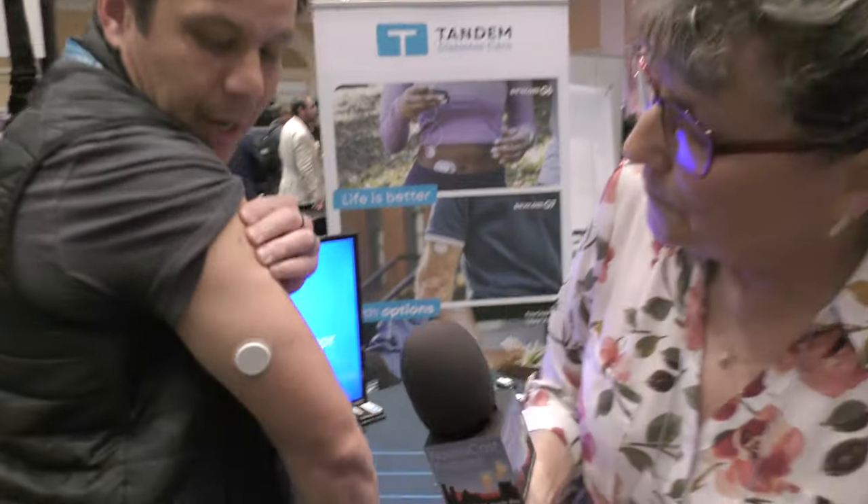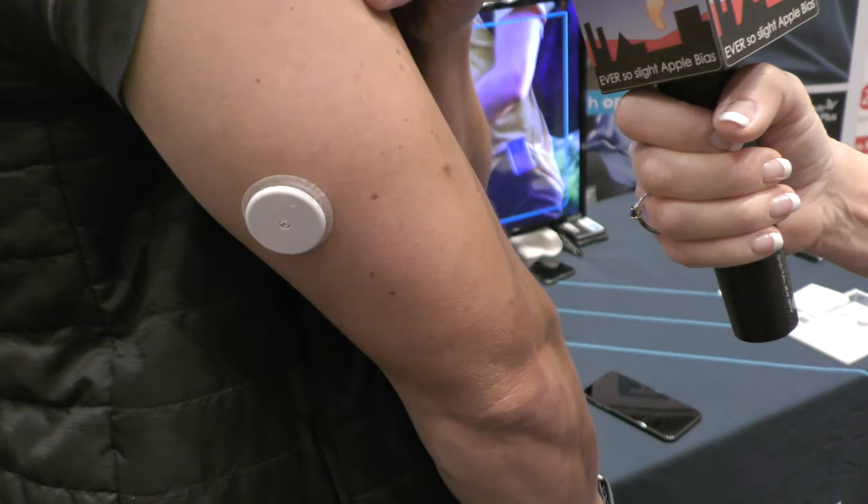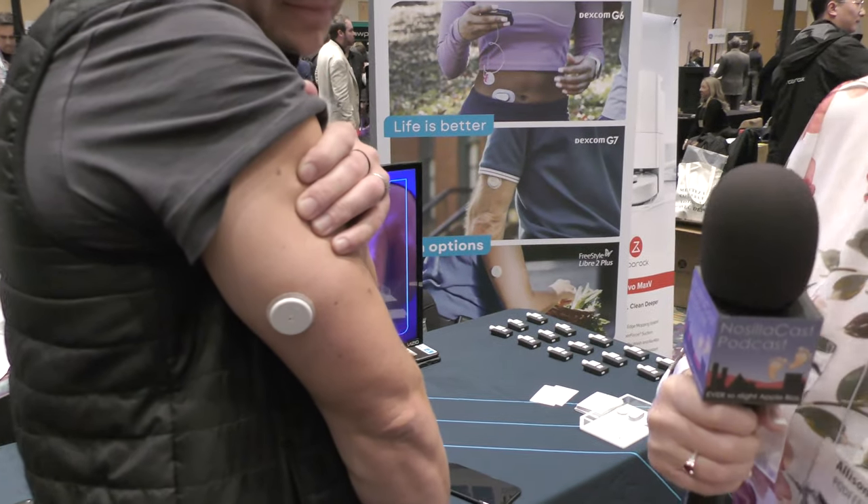From my limited understanding, taught by Dorothy, a continuous glucose monitor is something you stick to your arm — a little patch. He can show one right here: this is called the Freestyle Libre 2 Plus continuous glucose monitor by Abbott. It looks like an AirTag stuck to his arm, but it's a lot more — it actually has a sensor just underneath your skin that measures your sugar levels every one minute.